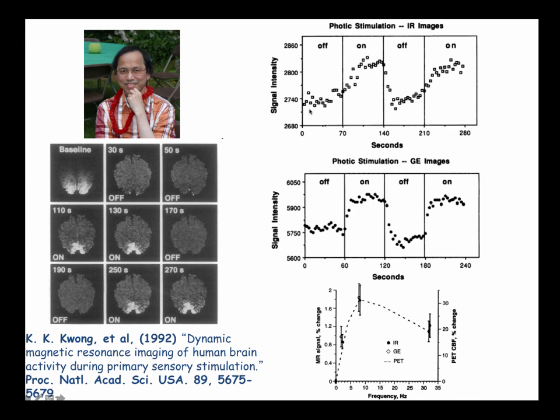He developed a T1 sequence that's sensitive to inflow or perfusion in the brain that also showed brain activation changes with a slightly different time course than BOLD. This is BOLD, and this is perfusion. And in his PNAS article he went even one step further, comparing it to activation as measured with PET imaging, positron emission tomography with, I think it was O-15, just flow imaging.